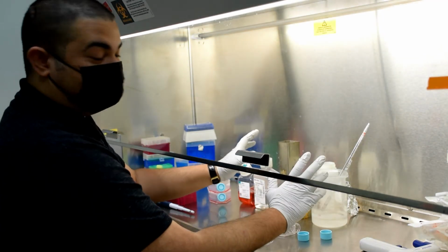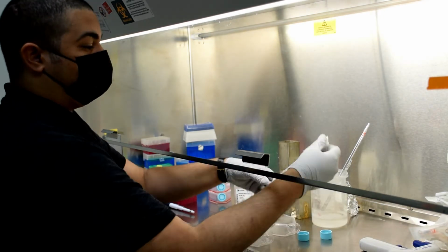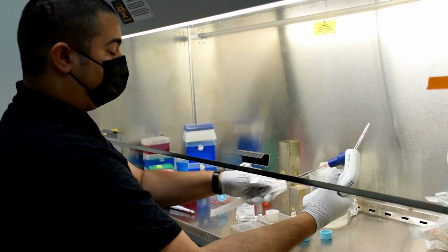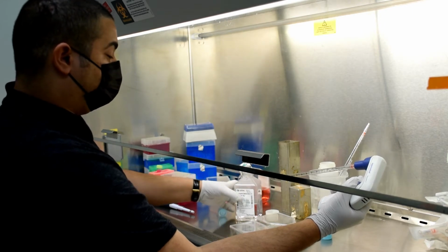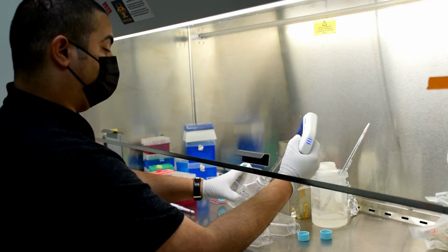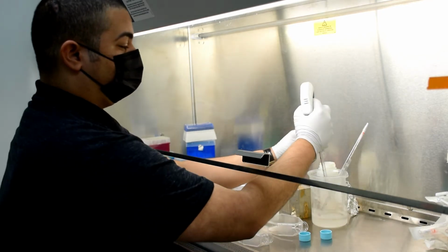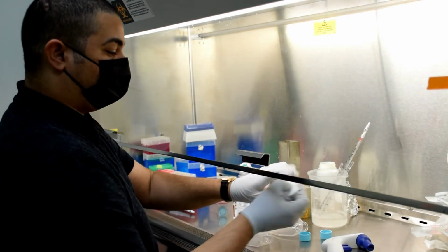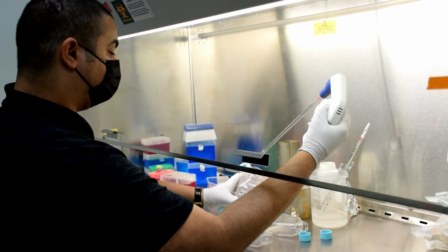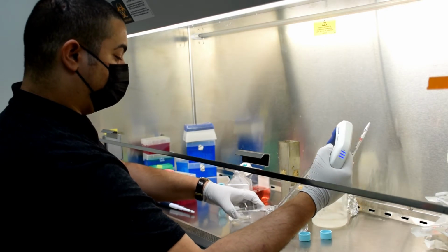Now I want to rinse the cells again with the buffer that I mentioned. So we're going to take this off and bring over a pipette. We're going to put it here. Again, same concept, make sure that nothing touches the actual tips. And then you want to aspirate a certain volume. You want to gently wash the cells. We're going to do the exact same thing with the additional flask. Take it off nice and slow. Take out some liquid, buffer, same thing, and in.